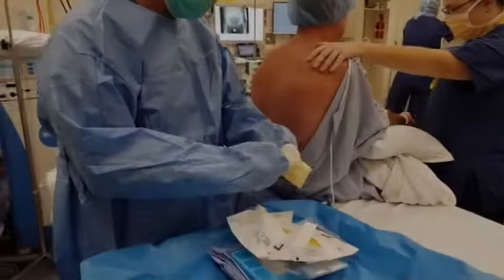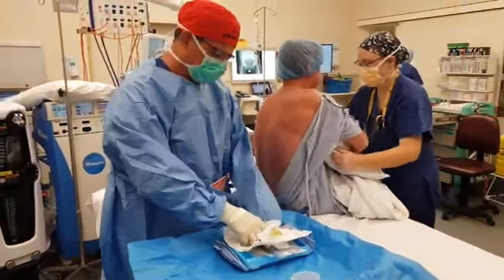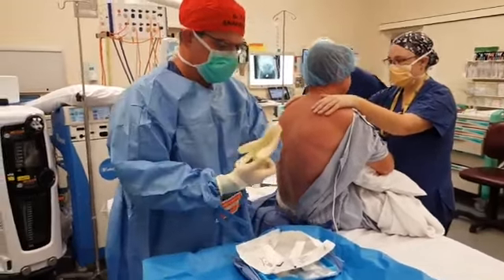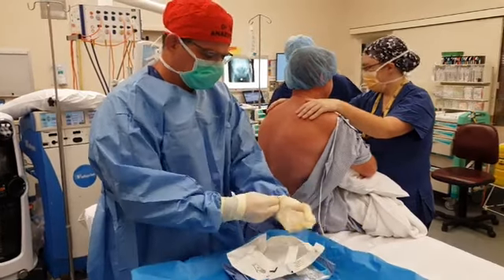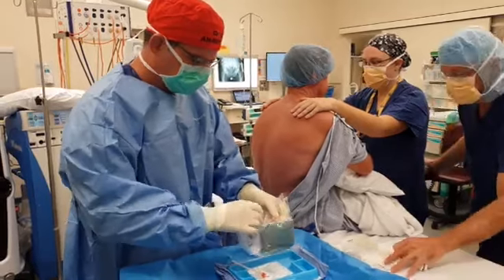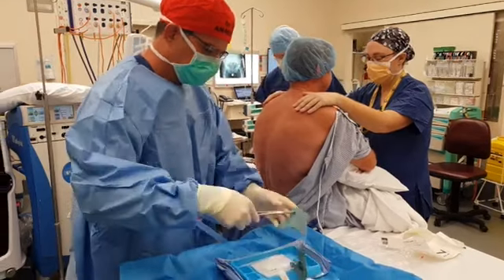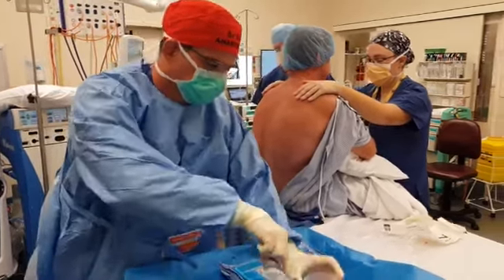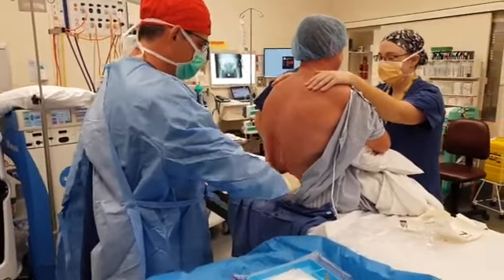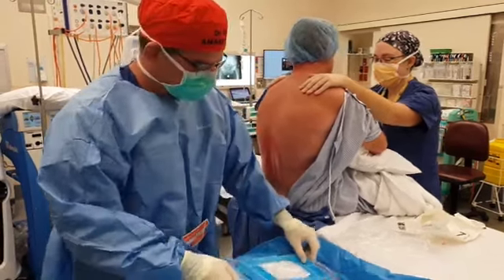Put a little bit of local in your back, and then we're going to put the spinal in. Doesn't hurt, and it's really good because it gives you excellent pain relief. Okay, so you'll wake up and you'll be really comfortable. And it really helps us mobilise you this afternoon. Thanks, very cold. That's about the best back I'm ever going to have this year, I reckon.